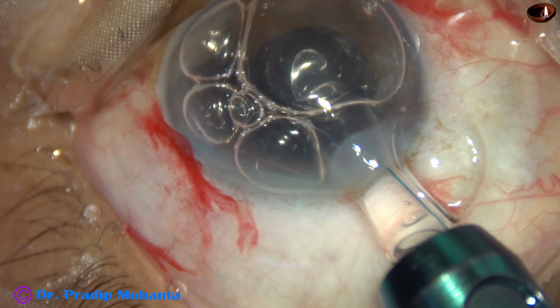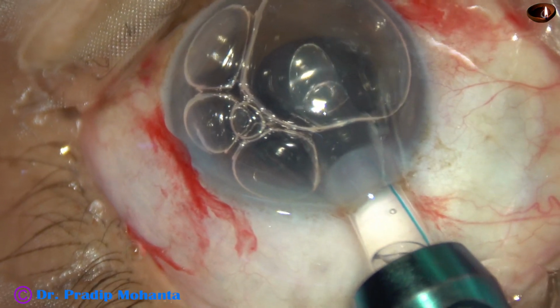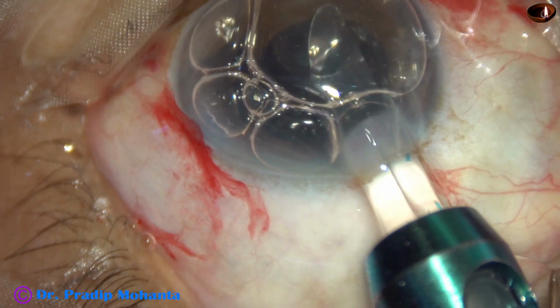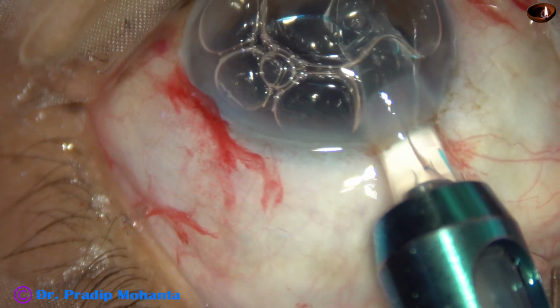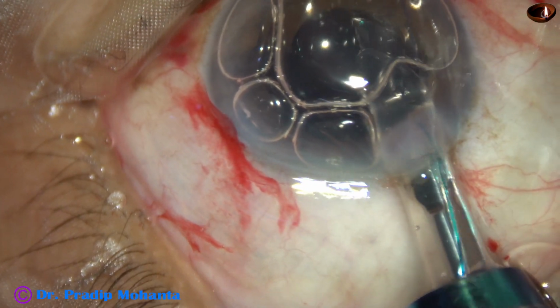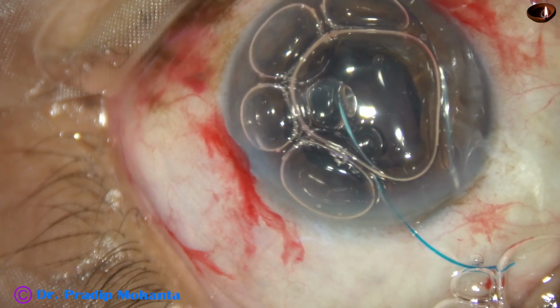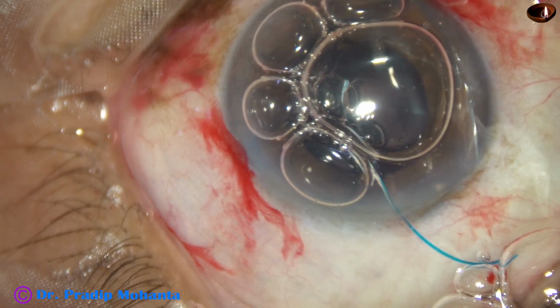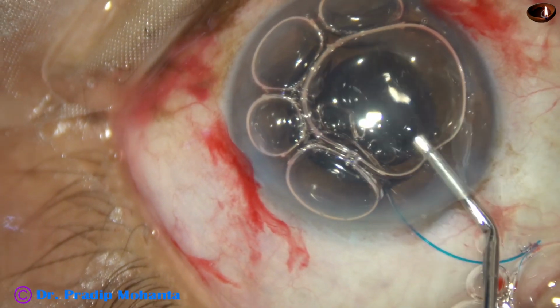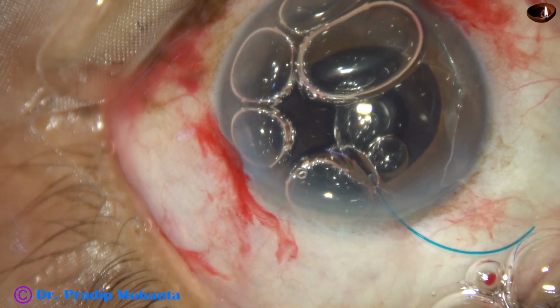The incision should be a little large so that the cartridge goes inside, and now the haptic is placed over the iris. No attempt is made at this time to place the haptics in the sulcus. Leading haptic is placed over the iris, trailing haptic is outside, and now over the anterior surface of the lens, a little bit of visco is injected.